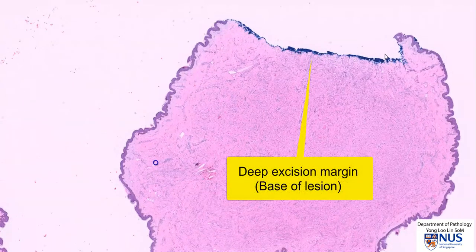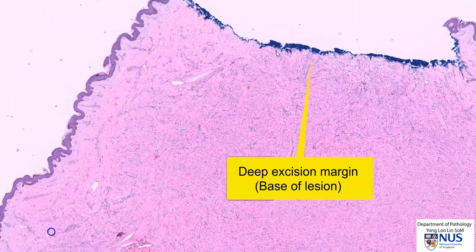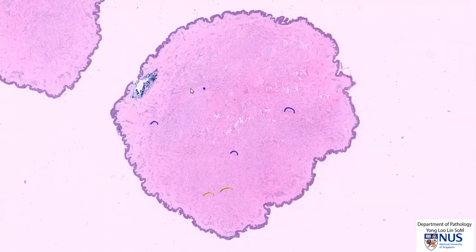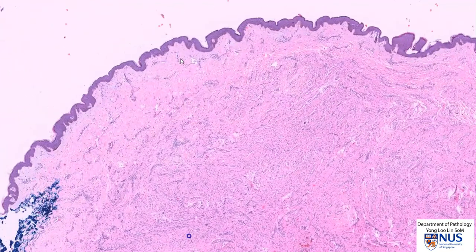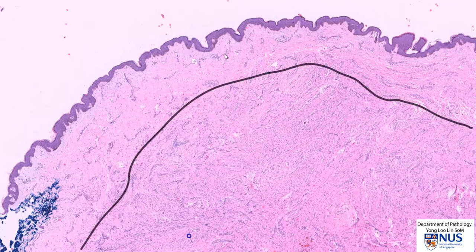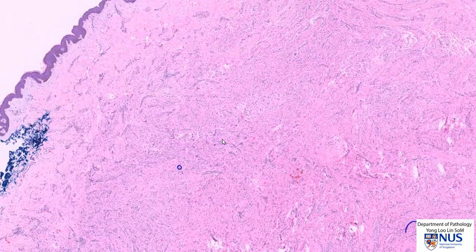This blue inked edge here is the deep margin of this lesion, and it is at the level of the dermis. This is not a well-encapsulated lesion with a fibrous capsule, but we can just make out the lesional area because it appears a little bit darker on low magnification when you compare it to the overlying dermis. This is because this lesion has a higher concentration of cells.